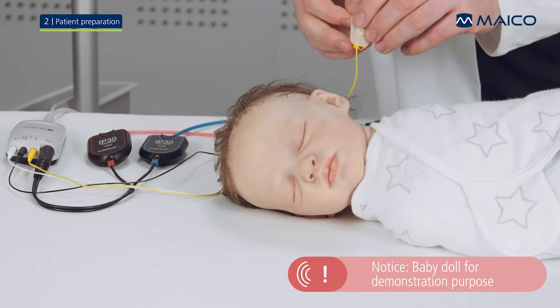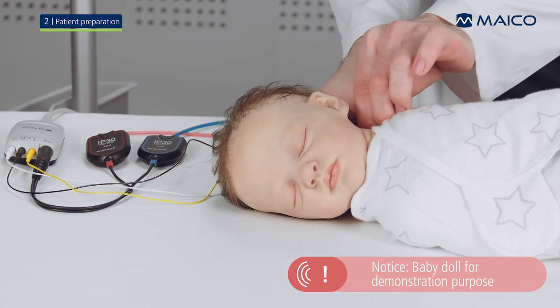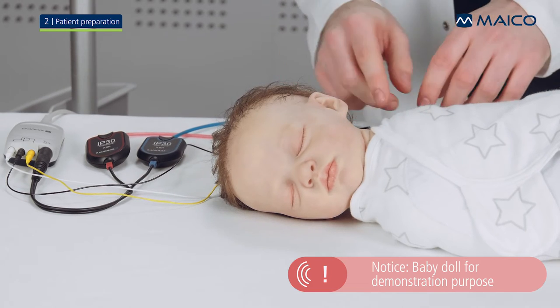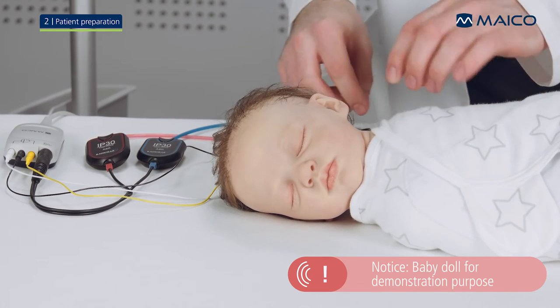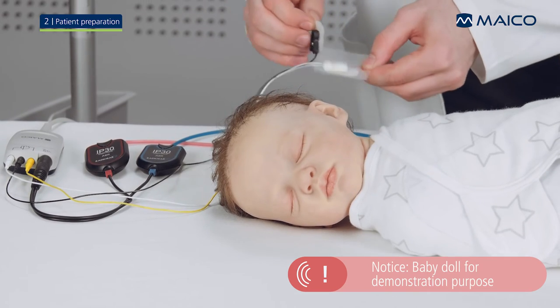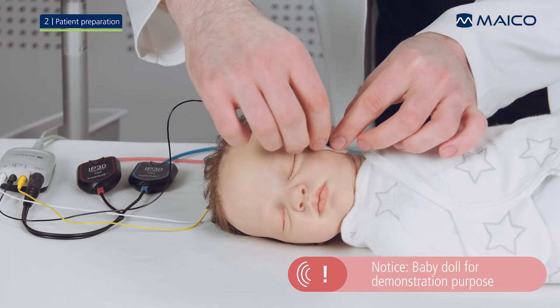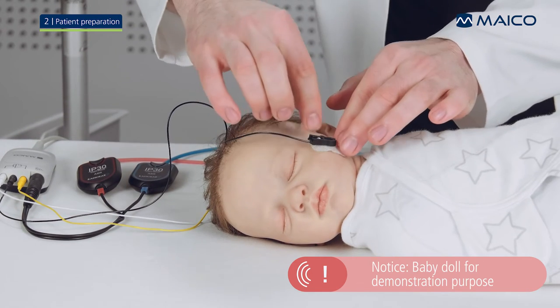Now place the electrodes on the prepared spots. Place the electrode with the yellow cable on the baby's neck, as depicted on the EZ-Screen test screen and on the picture on the pre-amplifier. Put the electrode with the black cable on the cheek and the electrode with the white cable on the forehead.